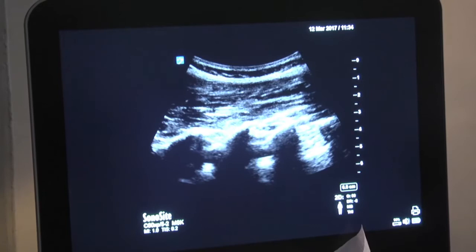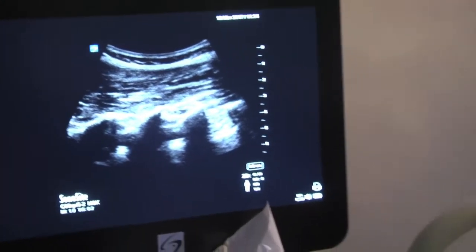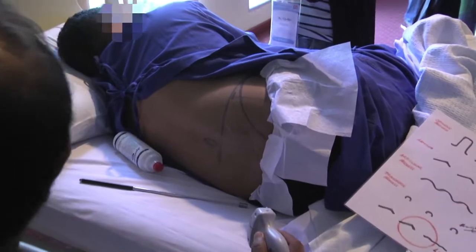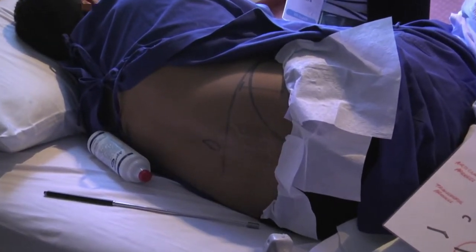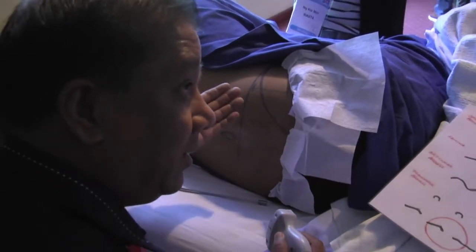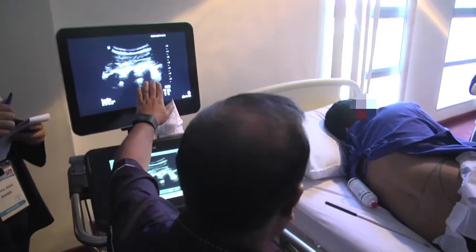So sometimes in difficult spinals, when you're doing a scan, somebody calls you or you are doing it and you find it's very hard, just abandon it and have a quick scan. You will find that maybe the space you are doing it, you can't see the anterior complex. This could be avoided if you had done a scan before. So proactively, if you preemptively do a scan, you will know exactly.